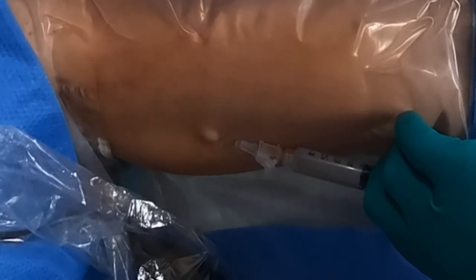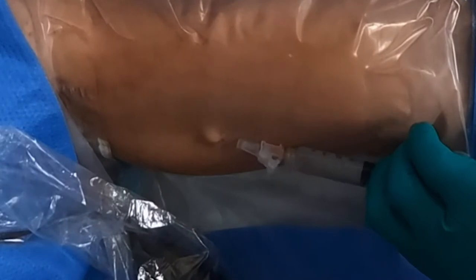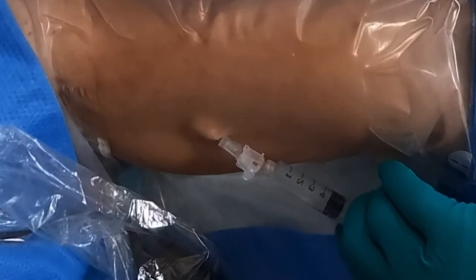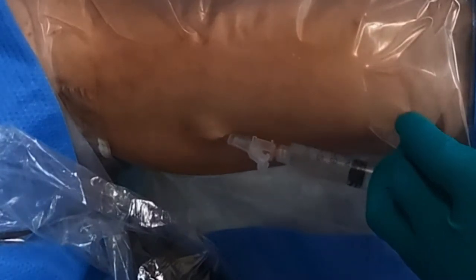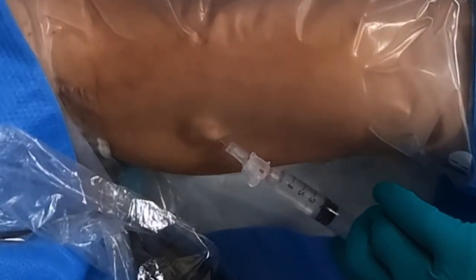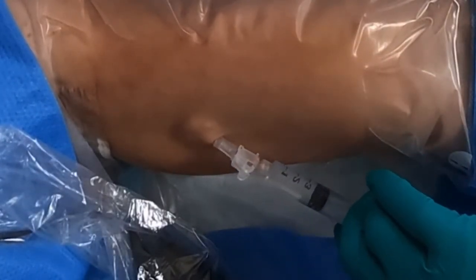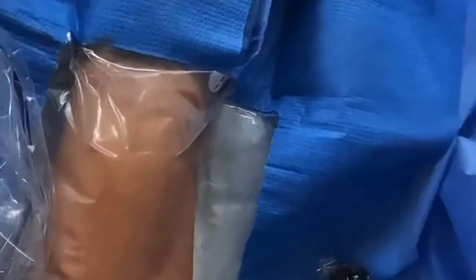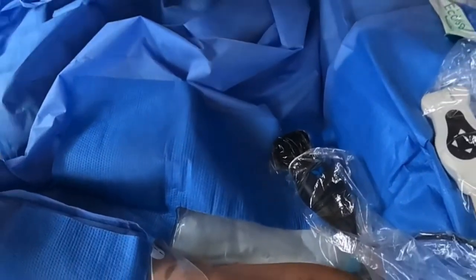What about now? Nope. Going a little faster. Have you been out in the sun a lot in the last 10-15 years? A decent amount — beaches. Okay, so there's a potential for thick skin and difficulty with the dilators, so I'm going to give him a nice big wheal. A long history of sun exposure thickens the skin — which is great, but also thickens the skin.